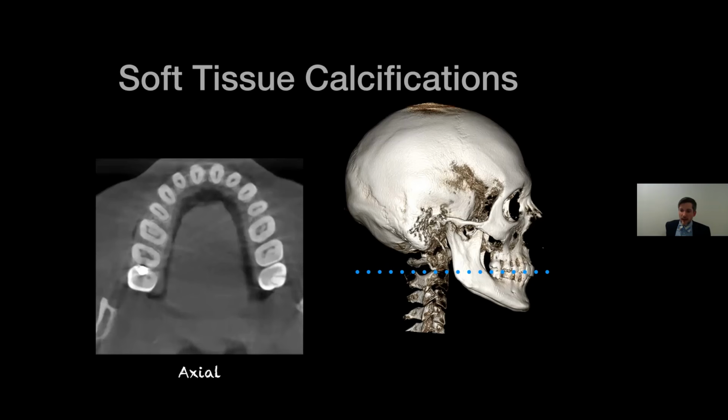So the dose does depend on the voxel size that you choose. So 600 voxel size, that would be more than sufficient for general dental diagnosis. If you needed fine detail, you could go to a smaller voxel size. That would just require a little bit more dose.